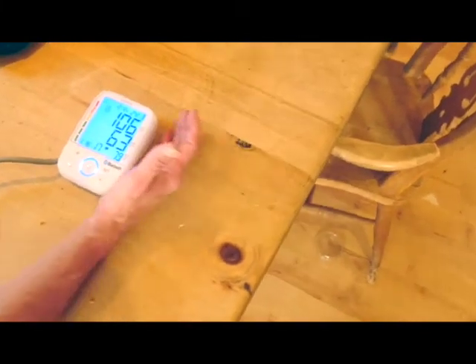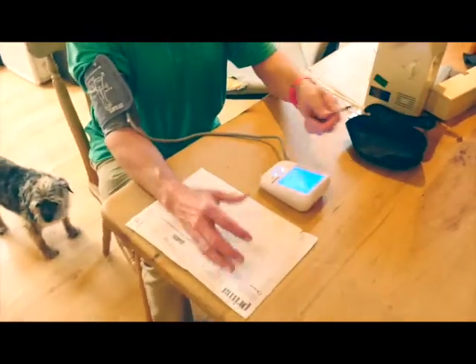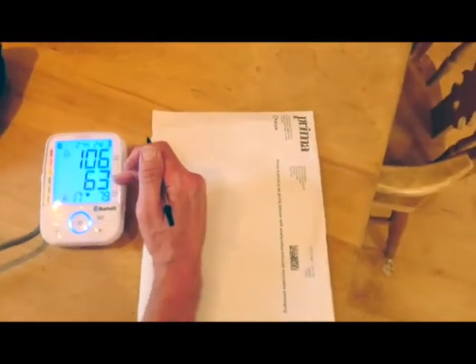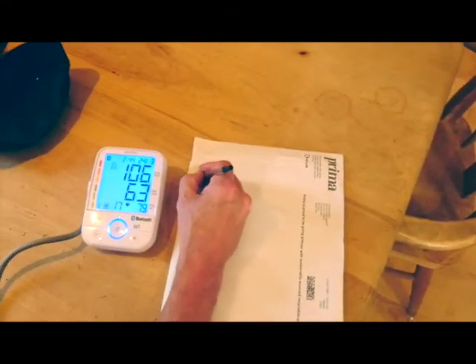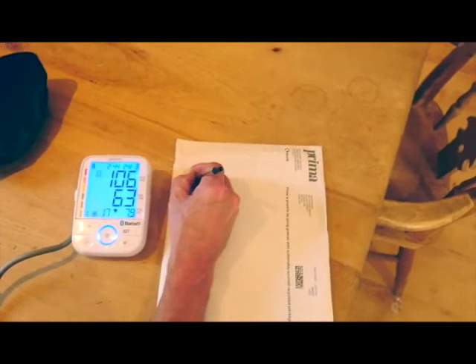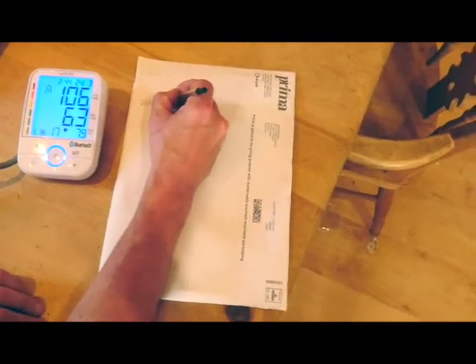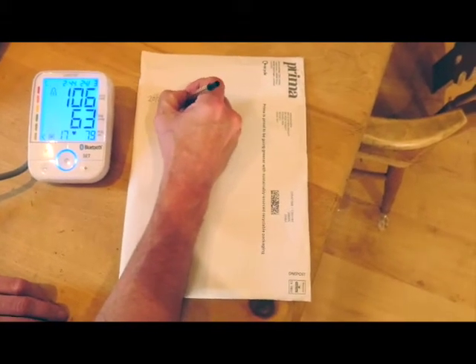Then what you do is write down your numbers. So if we come and have a look at these — you've got your systolic, that's your upper blood pressure; your diastolic, that's the lower blood pressure; and your pulse rate. So what you'd do is write down today's date. And we're going to write that down — so that's 106 over 63.